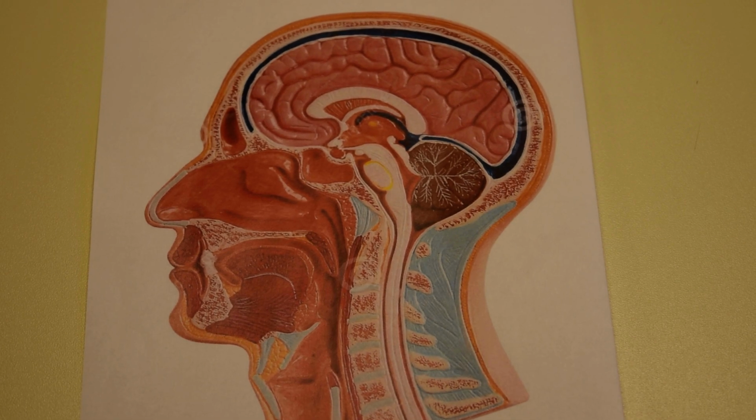So this video is going to be a tips and tricks on some of the difficulties that you might be running into in inserting your NG tubes. This is not a complete insertion video. I will try to do that one at a later time, but for now I just wanted to give you guys tips and tricks that may be helpful in helping you be successful in inserting your NG tubes and alleviating some of the difficulties that you've been running into.